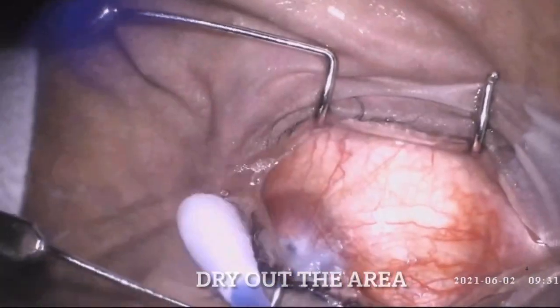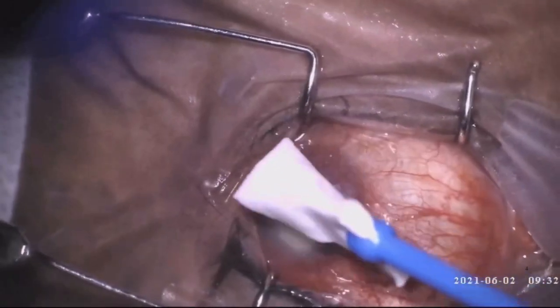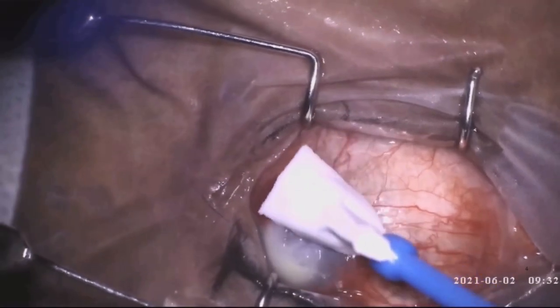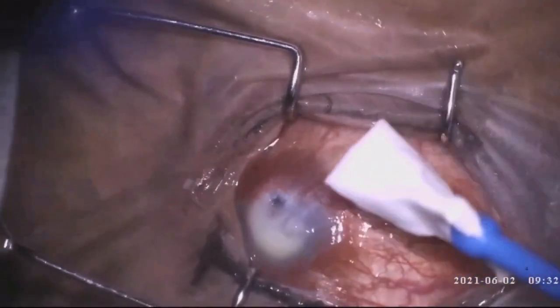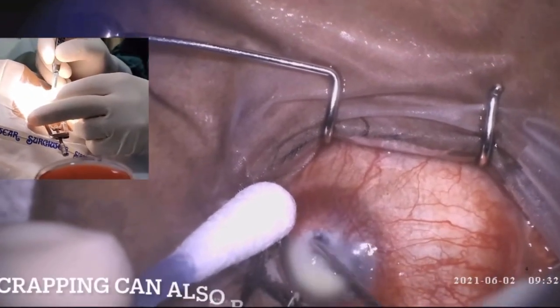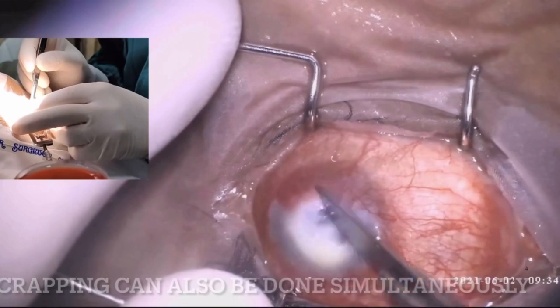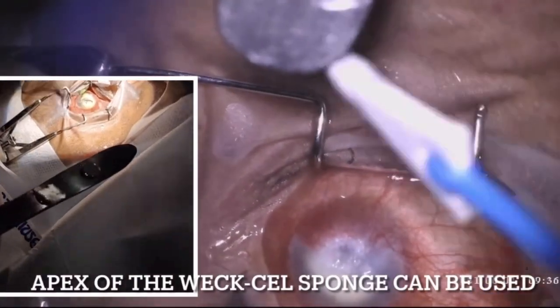It is important to dry out the area. If you apply tissue adhesive on a wet surface, it can lead to mound formation. After drying out the area, we debride the surrounding epithelium so that the tissue adhesive can stick on it.